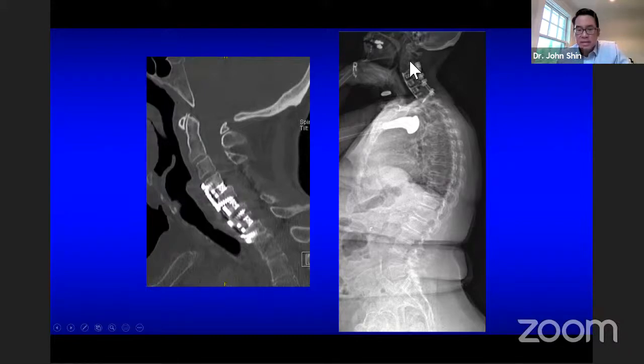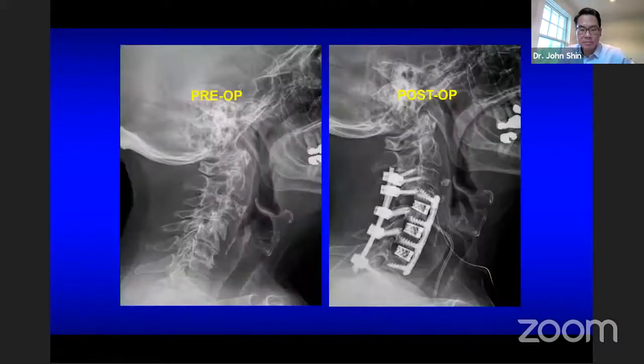And you can see here what the cervical alignment looks like relative to the lumbar. Again, I'm very happy with this, but I was also very happy to look at that occipital C2 angle in that interval. You can see that she's not hyperextending to look straight. I mean, she's looking up just because the x-ray techs have them put their hands over their chest so they're not leaning forward or holding a bar, but it just shows that she's not maximally extending her neck to maintain that gaze. Again, pre-op and post-op.